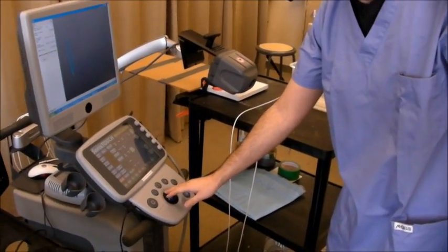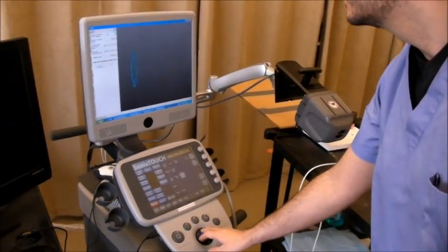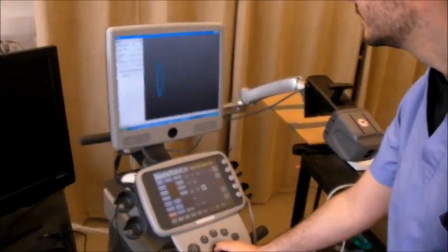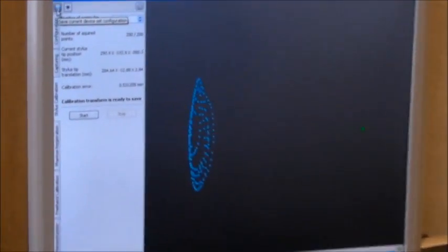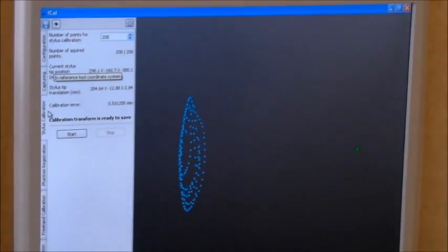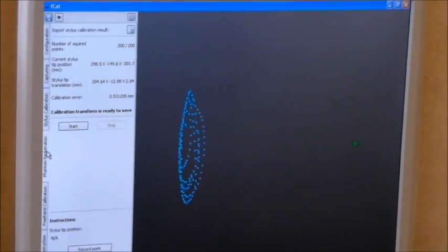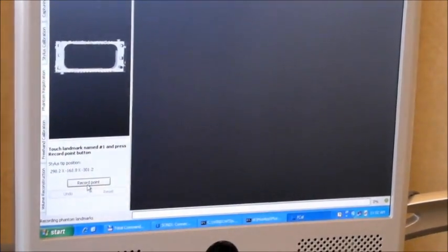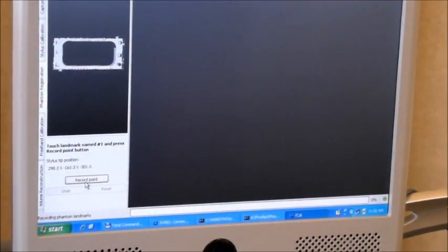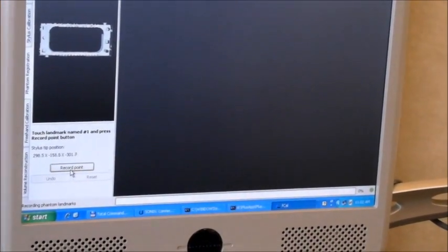If you wanted, you could save the configuration file now, using this disk button, and continue from this point. If you load that file, it will save. Now, I'm just proceeding to the Phantom registration phase.